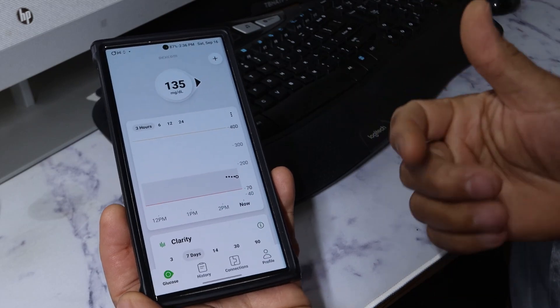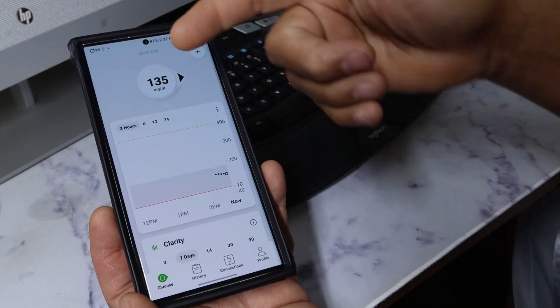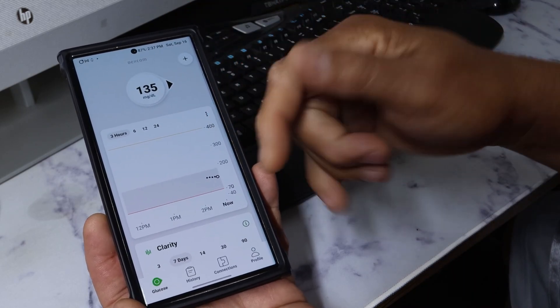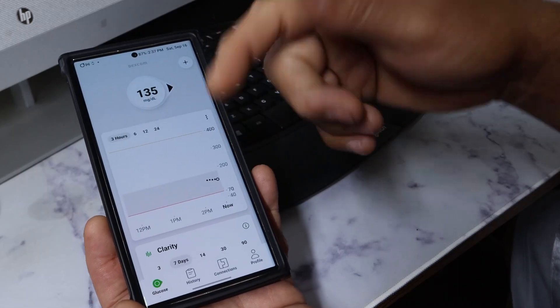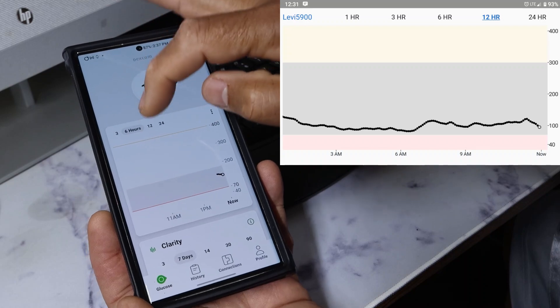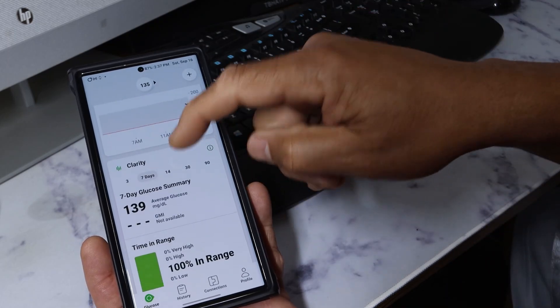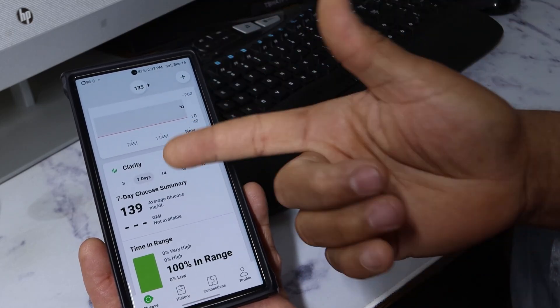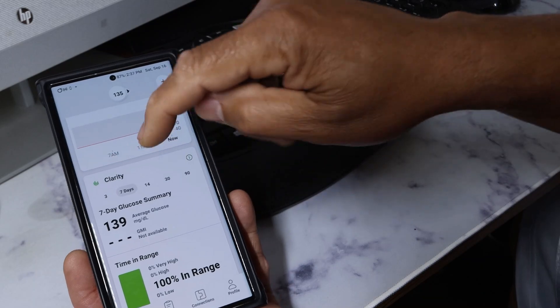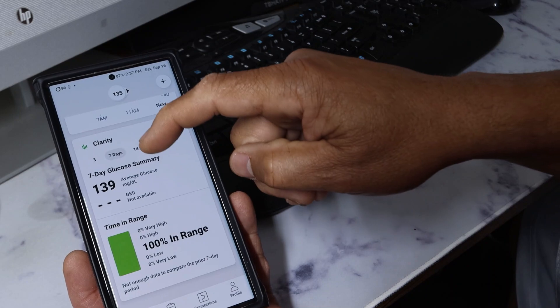The sensor is done setting up, and I like the interface so far compared to the G6. You can see everything is at your fingertips — it shows you the general number up top, which right now is 135. It just started so we don't have a proper graph yet, but you'll have a full graph and you can choose 3, 6, 12, or 24-hour views. Down here, Clarity is built right in — normally Clarity is on a separate app or you'd go to your computer, but it's integrated here, so you can look at 14 days of data.